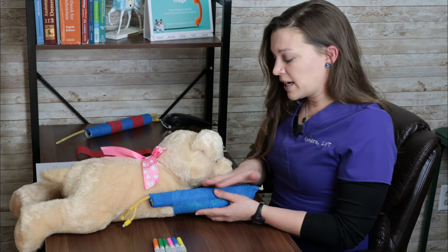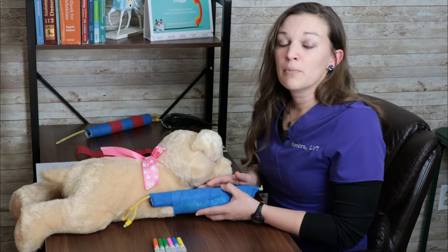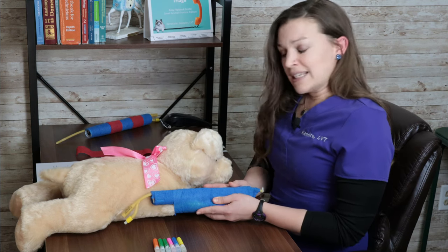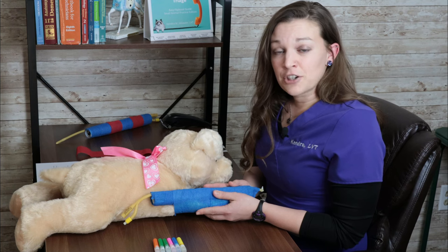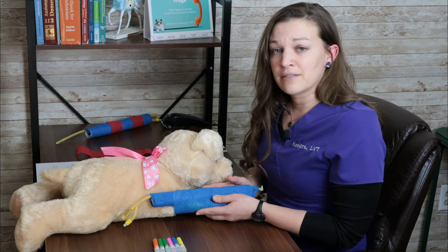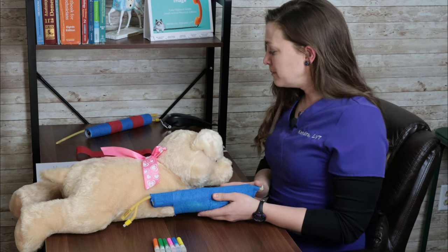So do all of your touching and feeling of the vein before we get the area clean, okay? It doesn't matter whether you're wearing gloves or if you wash your hands before, you're still gonna make the area dirty by touching it again. So feel before, clean after.